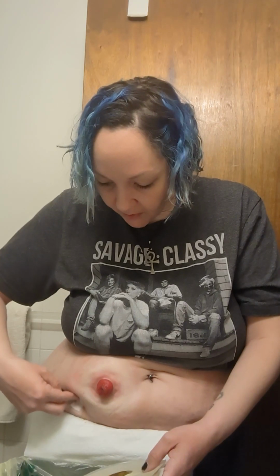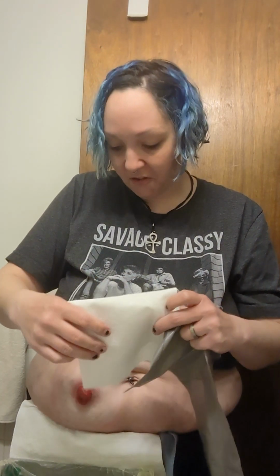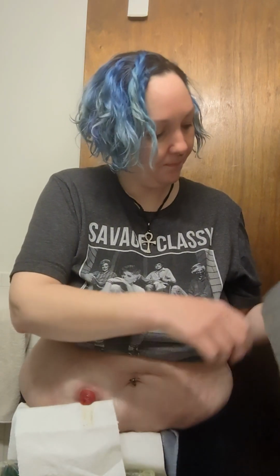Okay, so now that we've gotten all the adhesive off, good timing for this video. I like to call this time of your bag change the danger zone. When you're in the danger zone, it's a good idea to not be too risky, too risque.